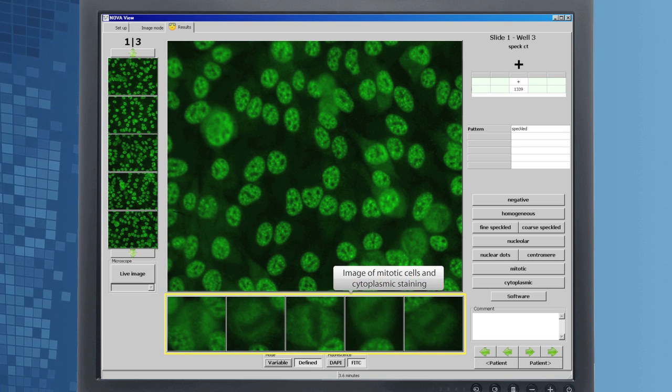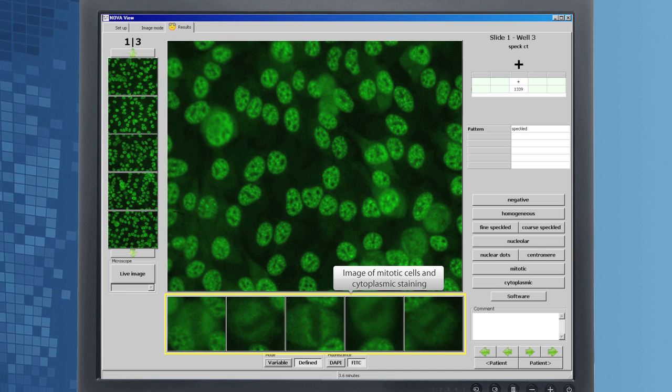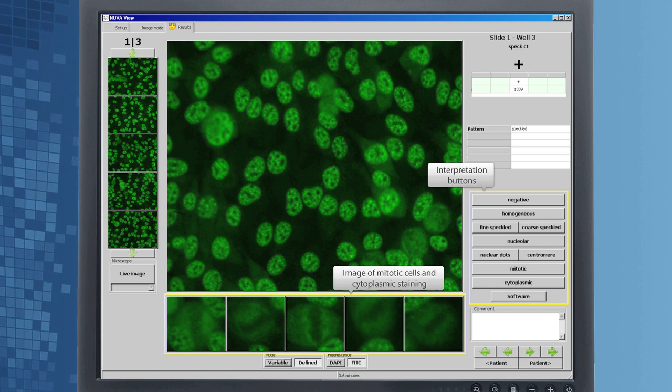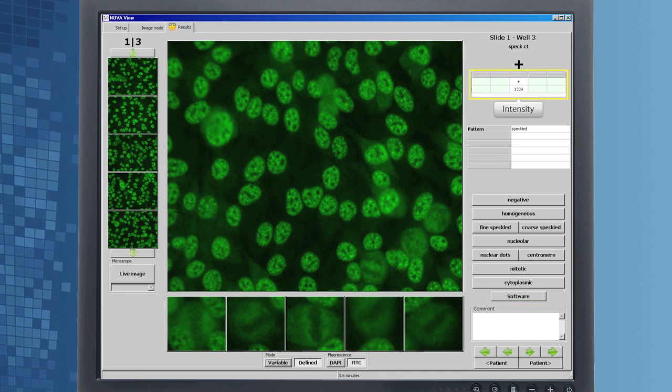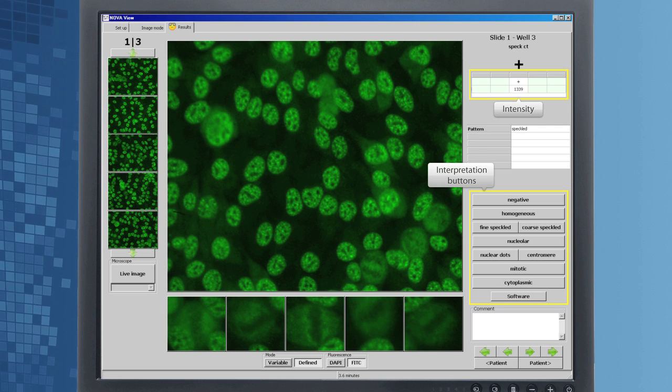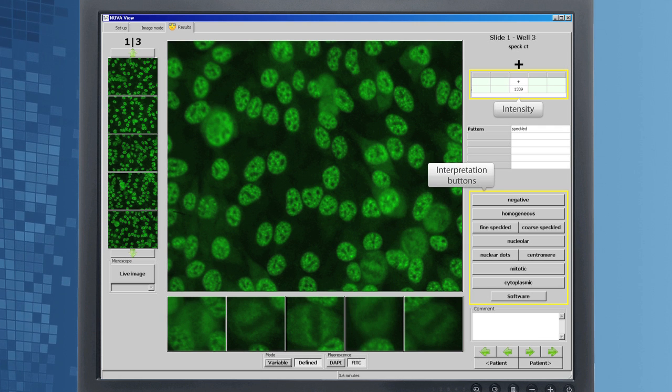Mitotic and cytoplasmic images are presented on screen to assist with the interpretation. NovaView provides light intensity units to support interpretation.